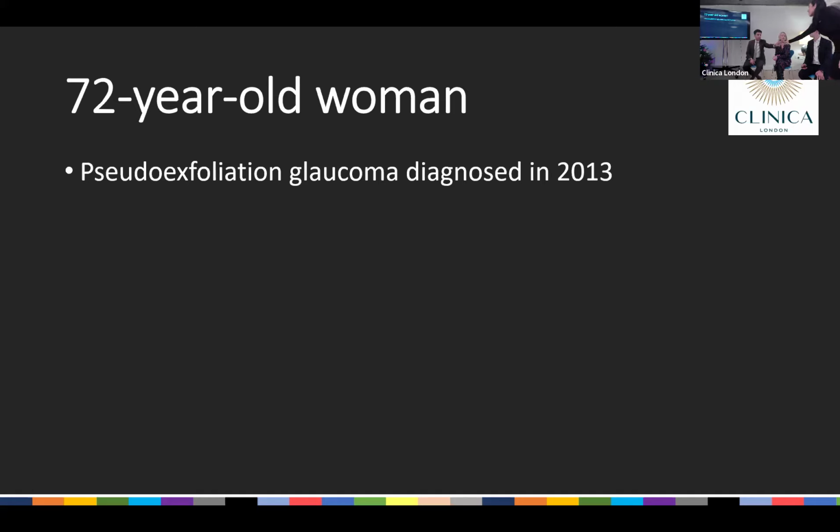I think there's progression analysis, which Anthony's shown with those lines showing downwards. It's pretty self-explanatory. You can show them that things are declining. So you can highlight, like, even though actually your functional test, which is the visual field, isn't, the RNFL thinning is showing that you've got early changes. And if we don't do anything, then you'll eventually get the visual field defect. I mean, you have to lose a third of your nerve fibers before you get a visual field defect.